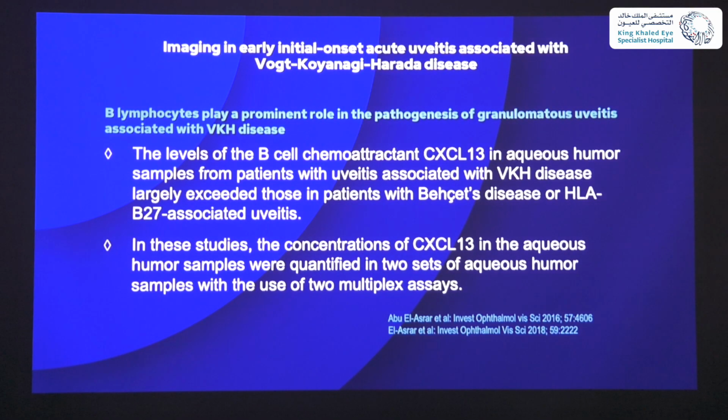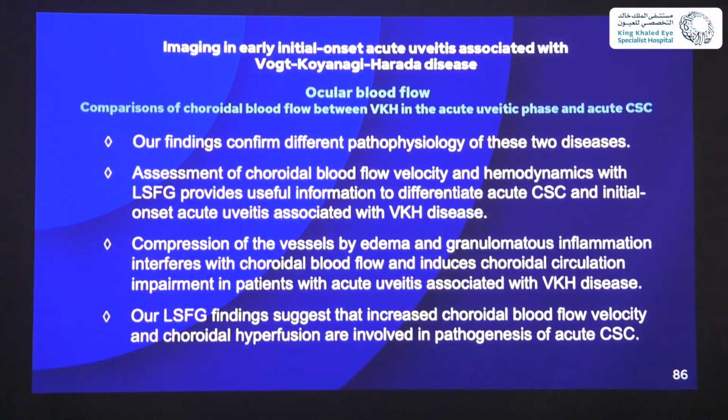So that means that perhaps in departments that have a laser speckle flowgraphy machine, it can be useful to confirm the diagnosis of central serous choroidopathy versus acute VKH disease.